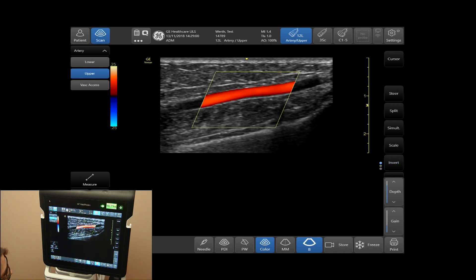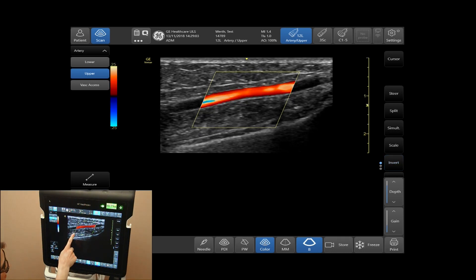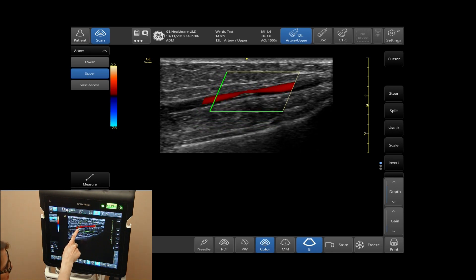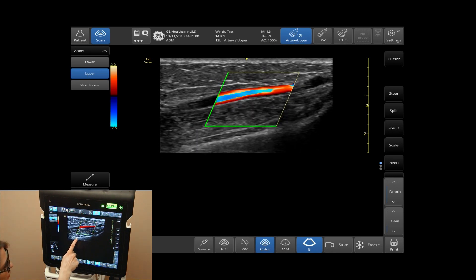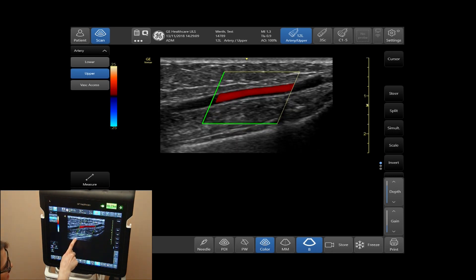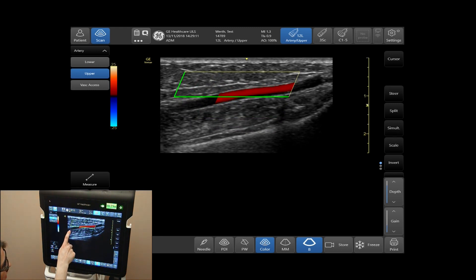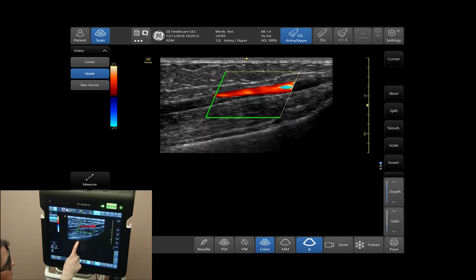To adjust the size of the color box, tap on one corner and this will simply allow you to increase the size and length of the color box.